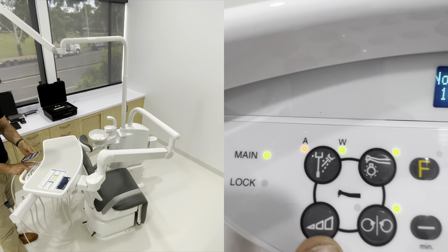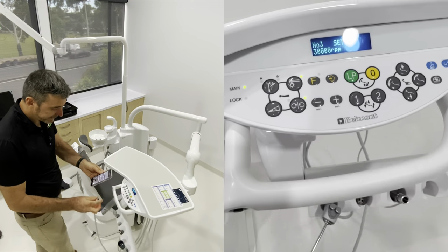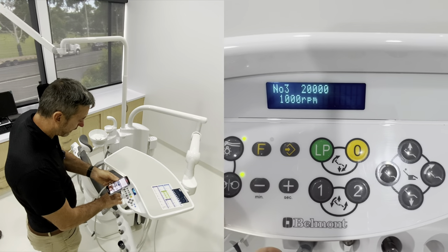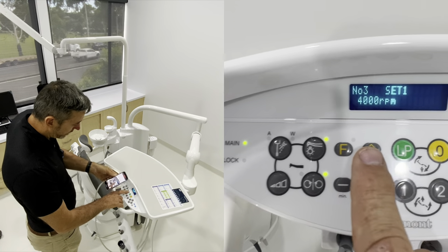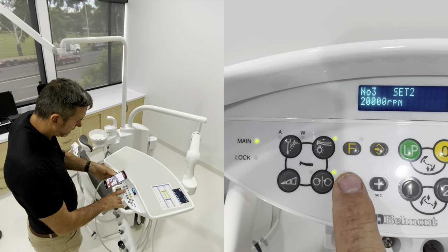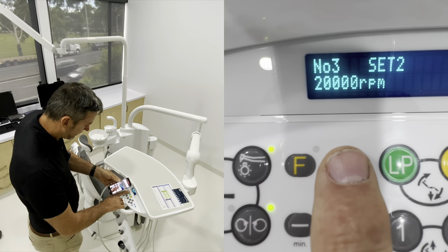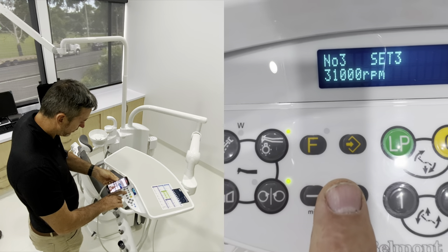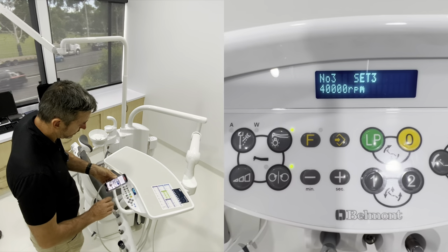If we hit this little button here, we're in preset 1, preset 2, and preset 3 - it's a presetable position so you can have any speed you want. Let's go back into variable mode. For appropriate work we might go to say 4,000 RPM and hit the little store button - that's stored in. Preset 2 at 20,000 RPM for caries removal - hold that down and it's locked in. Preset 3 might be for red band handpieces at maximum speed of 40,000 RPM. So you can pick that up and use it at any stage.